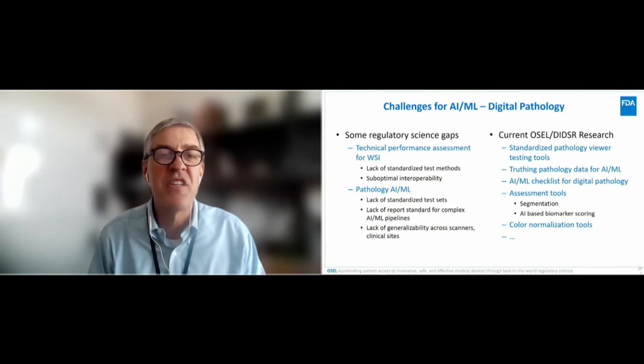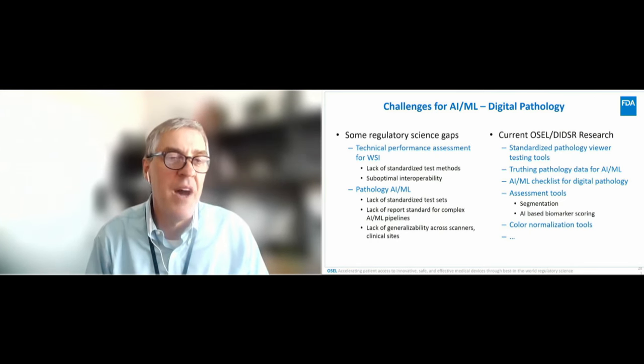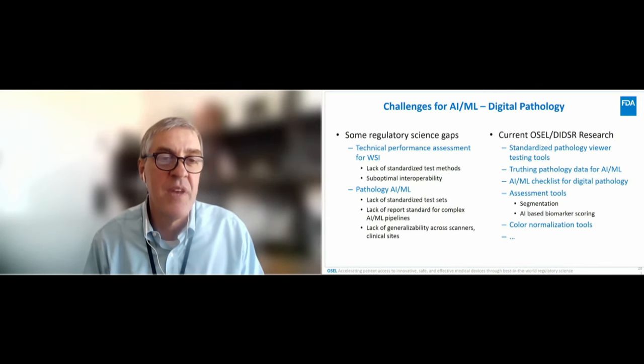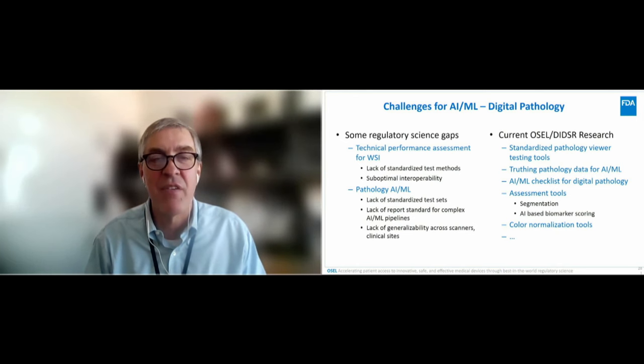So some challenges around the regulatory science gaps, and these are some gaps that we've identified from our group, but they clearly aren't all the gaps in AI and pathology AIML. But things around like the technical performance assessment of the WSI system. So again, there's a lack of standardized test methods, and there's suboptimal interoperability between the various systems. In pathology AIML, again, a lack of standardized test sets, a lack of reporting standards for complex AIML pipelines and assessment methods, and a lack of generalizability across the scanners and the clinical sites.